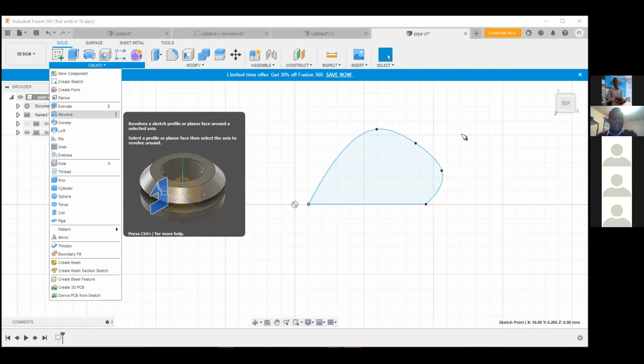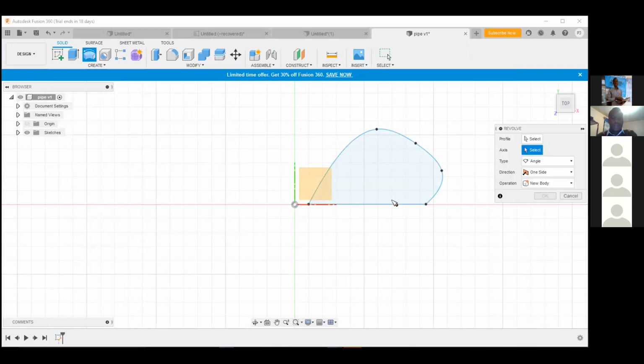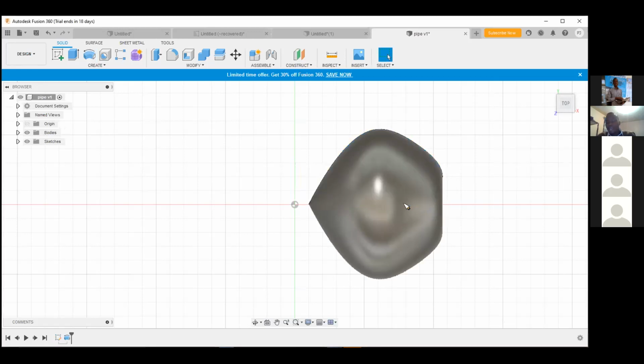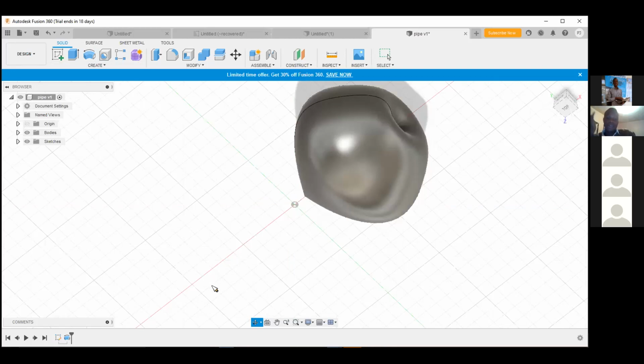Then create. Select profile first. Okay, select profile. Then axis. It is the bottom line. Yeah, click OK. Rotate it, then you'll see how it looks. Yeah, so that's how to revolve. It looks almost like an apple or something. Anyway, good job.